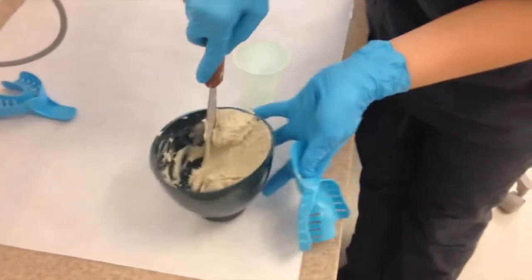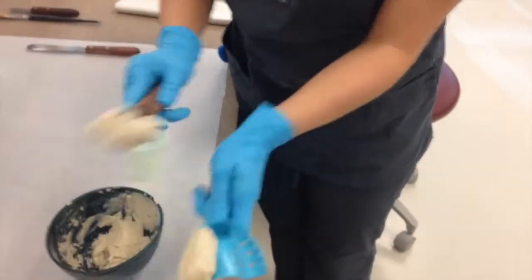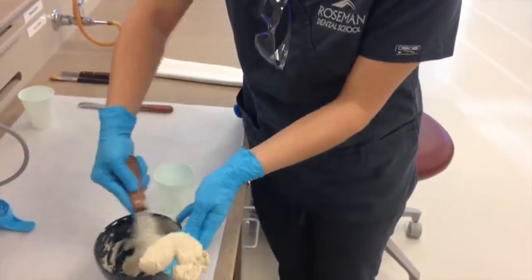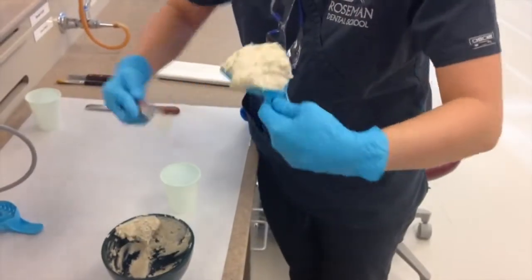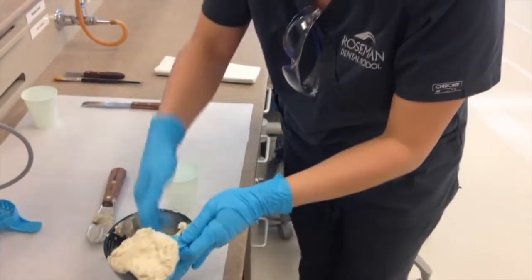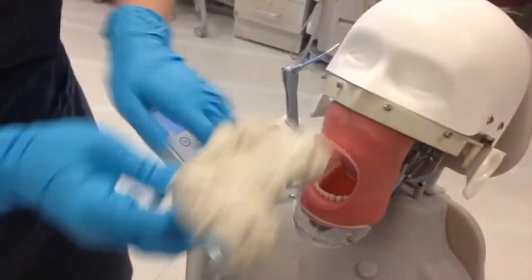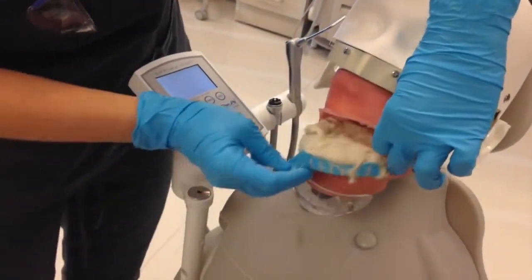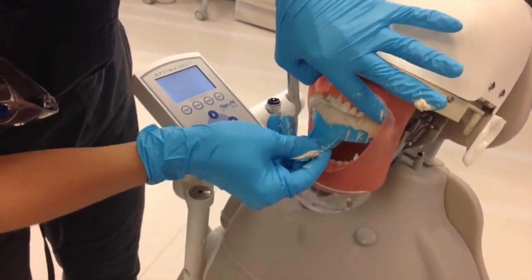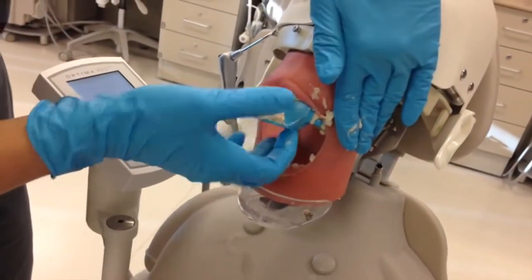Now it's time to load the tray with alginate. A great way to prevent blebs is to swipe some alginate on the occlusal surfaces of the teeth. Grab some on your fingers and firmly swipe the lingual, facial, and occlusal surfaces in the patient's mouth. Go ahead and place the tray into the mouth, retract the cheeks with your fingers, and press the tray gently upward. Don't push too far or the teeth will come through on the tray.